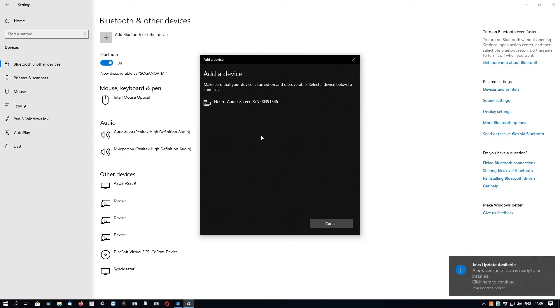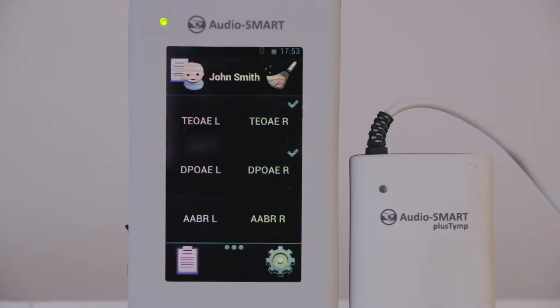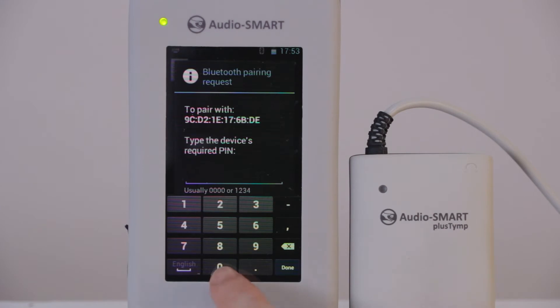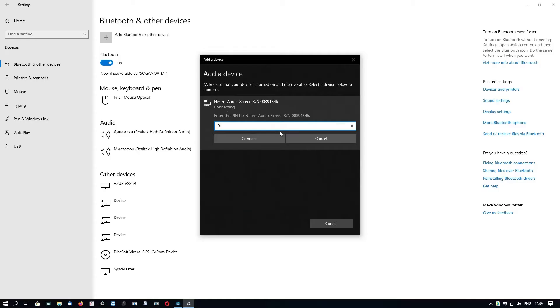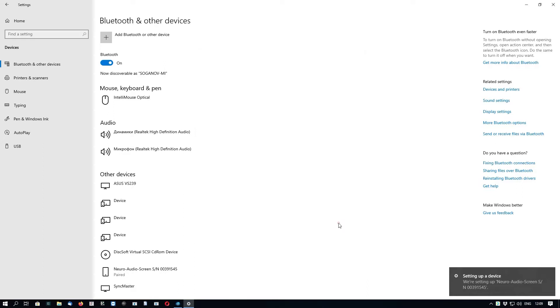Wait until the device search is finished. We can see our device, so we click on it. Then we need to enter the PIN code, which is four zeros, on the device, and click Done and OK. Then we need to enter the four zeros PIN code on the computer and click Connect as well. The device is now paired to the computer.